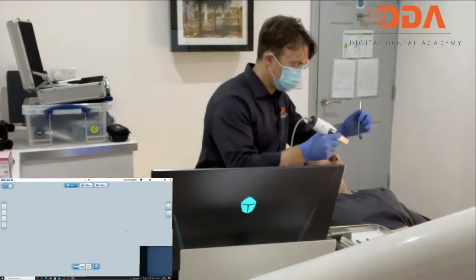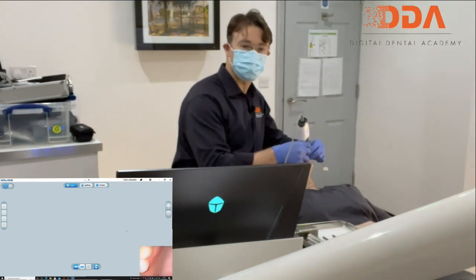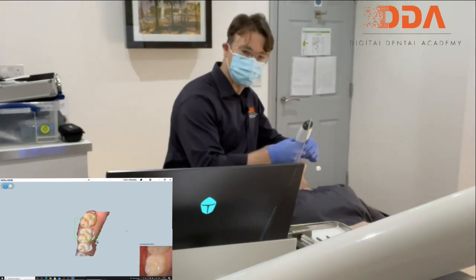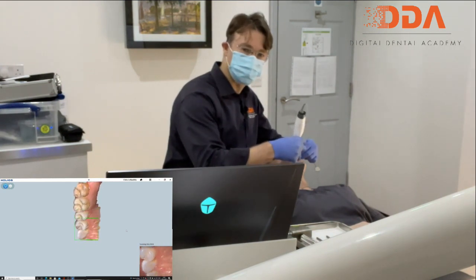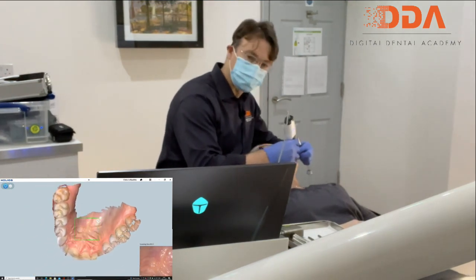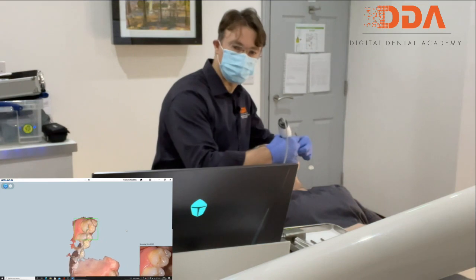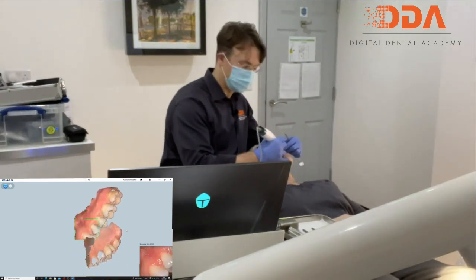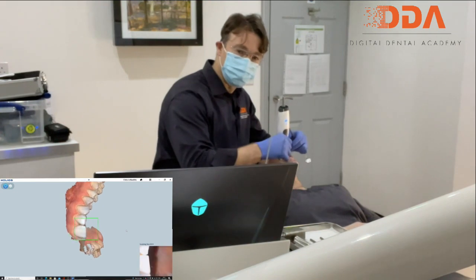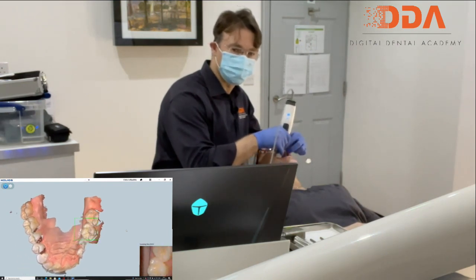We've got an image. You have to press the button and there we go. We've got a very good patient here who can open their mouth very nice and wide. So this is the first time that I've used the scanner, and first impressions are that it is actually quite fast, especially for a triangulation camera.